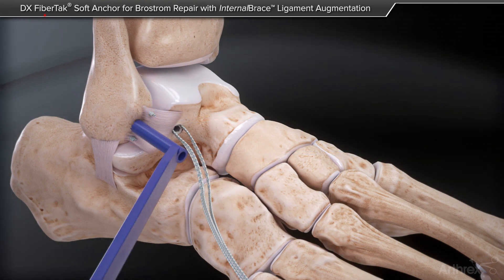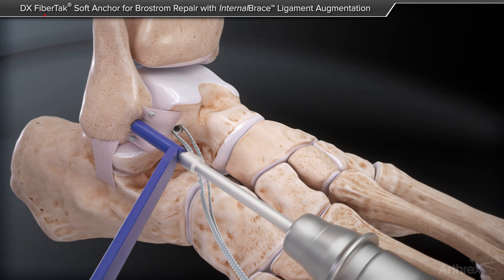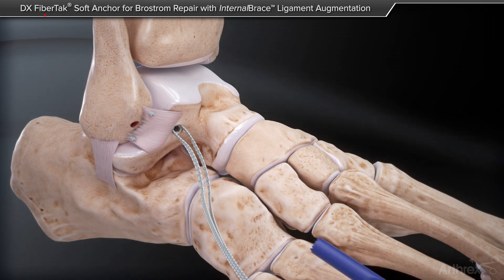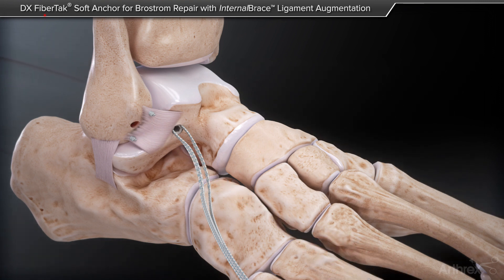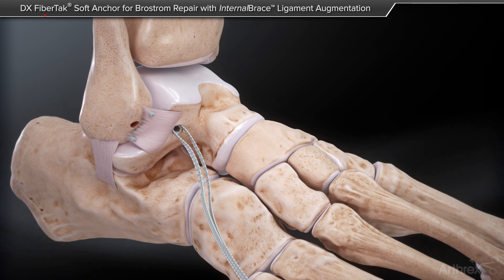Finally, measure 15 mm from the distal tip of the fibula and proceed to drill with a 3.4 mm drill and 3.5 mm tap to prepare the bone tunnel for the 3.5 mm SwiveLock anchor. Insert the FiberTape sutures from the preloaded 4.75 mm SwiveLock anchor into the eyelet of the 3.5 mm SwiveLock anchor.